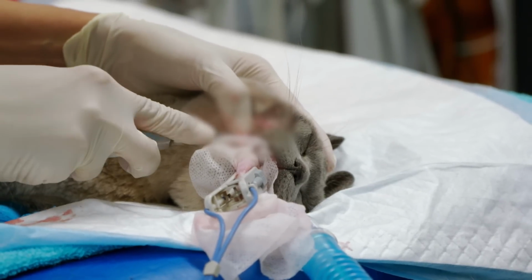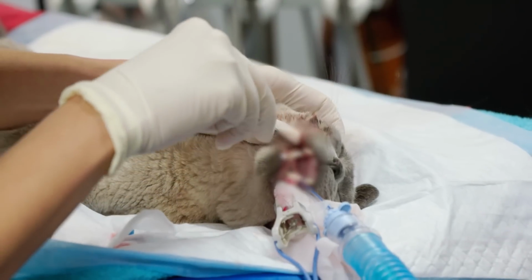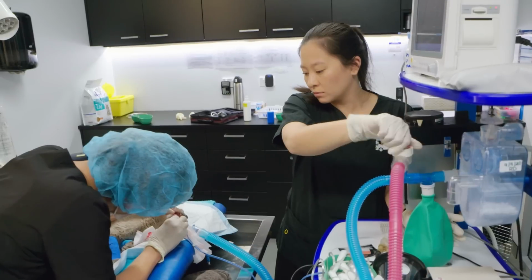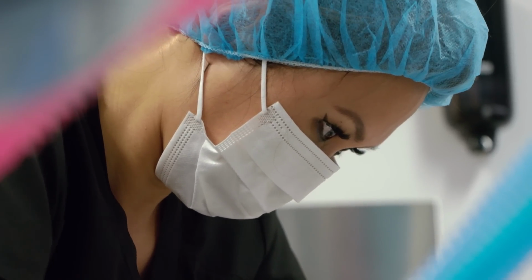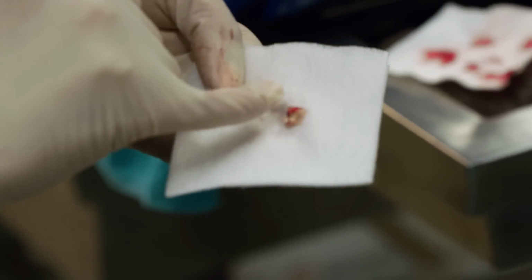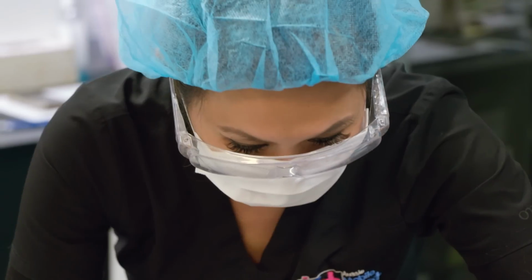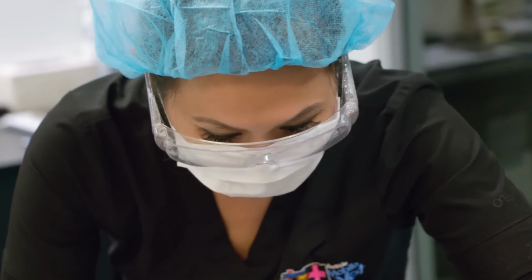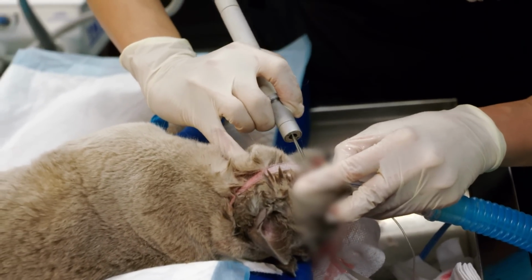What I'm doing is slowly pulling the gum off the roots very, very gently. And I'm loosening the tooth from its attachments to the jawbone. I can see that some of those roots have dissolved away, probably because the infection is so bad. It doesn't look like a normal tooth because all its roots have rounded off. So these roots should be much longer than they are. So it's going to be important moving forward from now, how we keep these teeth as clean as we can.